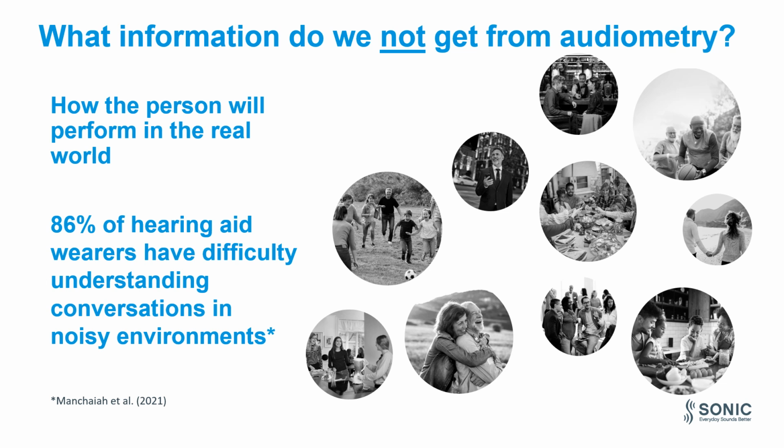So this problem remains to be the biggest challenge for HCPs and clients alike, because while the pure tone audiometry diagnoses a person's hearing loss, it cannot diagnose the ability to hear speech in noise.